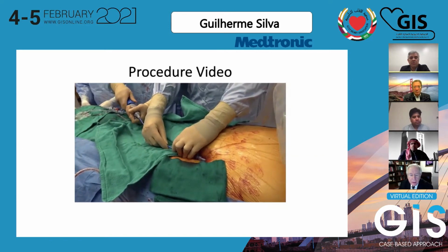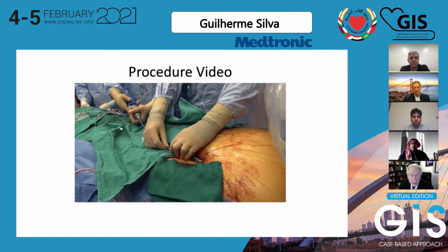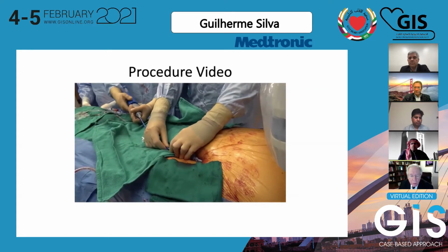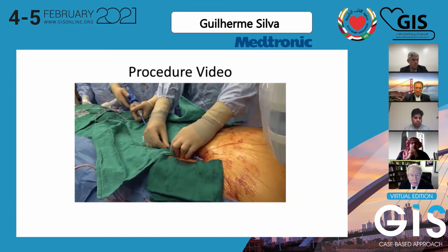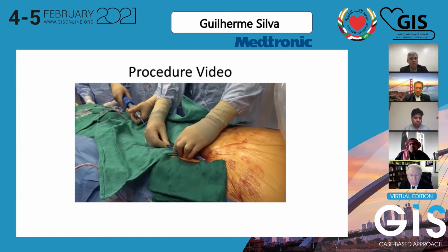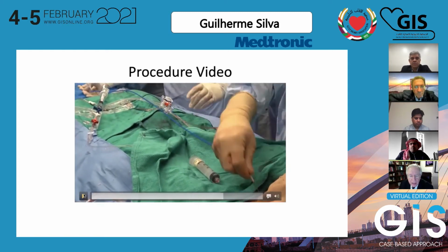If you look at the deployment, we go slow, and we have quite a bit of coordination between two operators. We do this 4 or 5 times a week together. Even with rapid pacing, these valves can move around a little bit, so slow, fine adjustments of the position are quite helpful. You could probably have seen my right hand move just a little bit. These valves sometimes have a tendency, because of the energy in the system, to advance slightly.